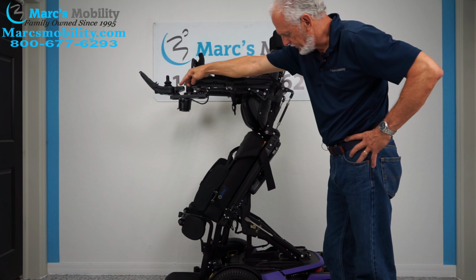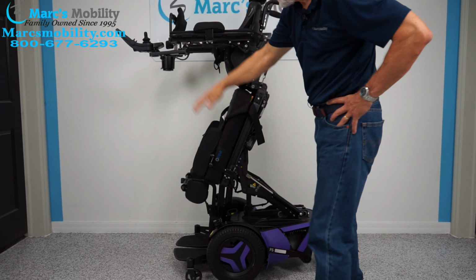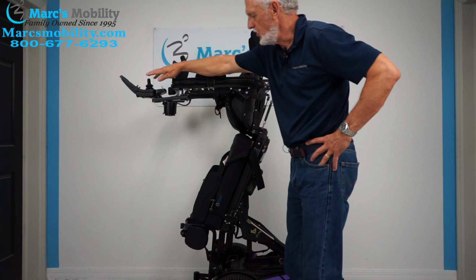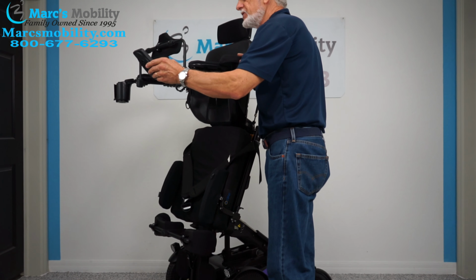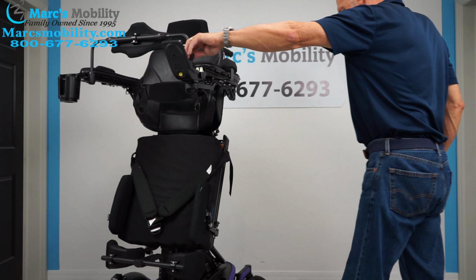You need those there. It's a little more support when you're standing. So this is the standing position. This is as far as it'll stand. It won't get you any further than this. That's just the way it's supposed to be, okay? And you can still drive the chair with the seat elevated or standing. Let me push this to the second speed. So you can still drive the chair with the seat elevated.